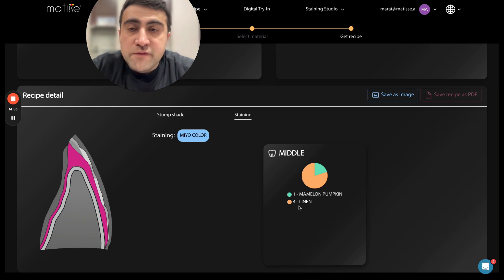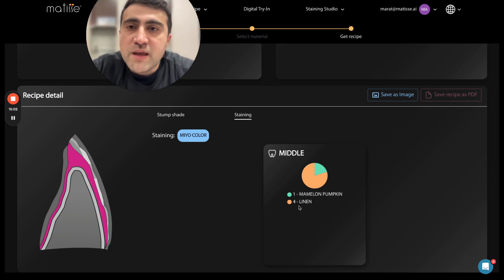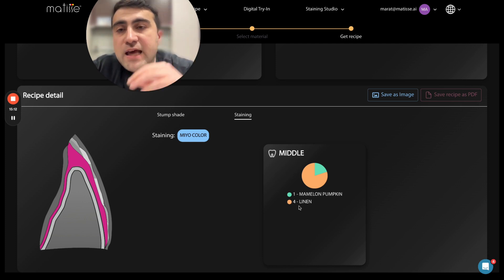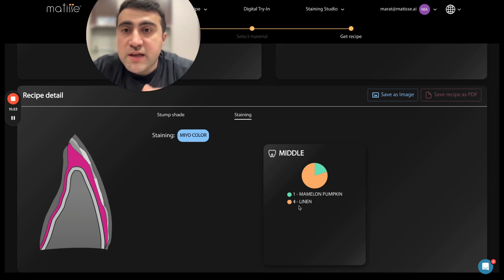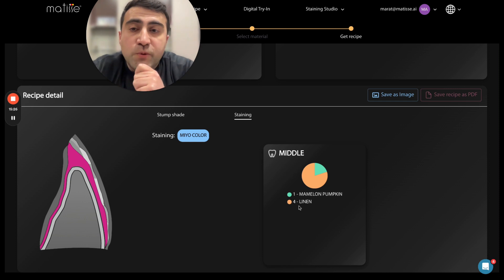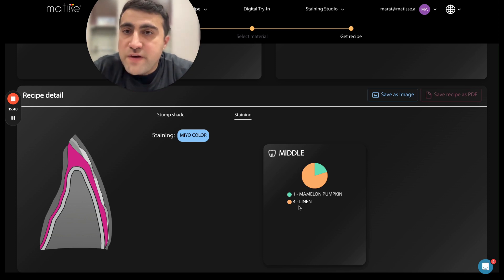Second, you can use your mobile phone to photograph shade guides — I'd advise using standard lighting such as MDP2. Third, you can use Optishade to identify the shade guide color: take a picture with Optishade, check the app for the closest match — for example Vita 3D Master 2M2 — then place that shade tab in the mouth, make a photo, and continue in the software to generate the recipe. Shade Guide AI is a very straightforward protocol with fewer steps — you take the recipes and fabricate the crown.